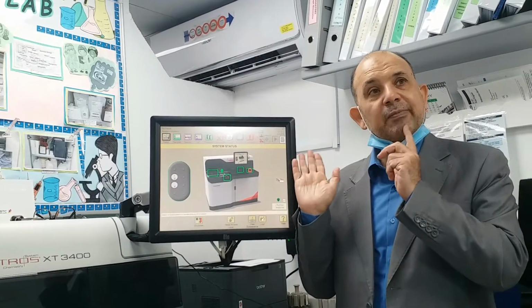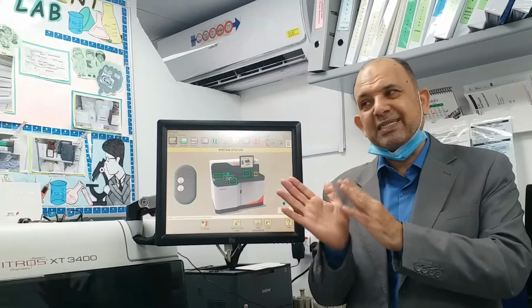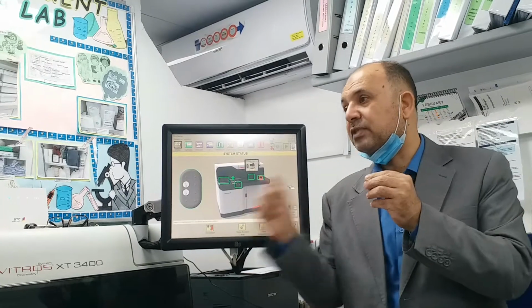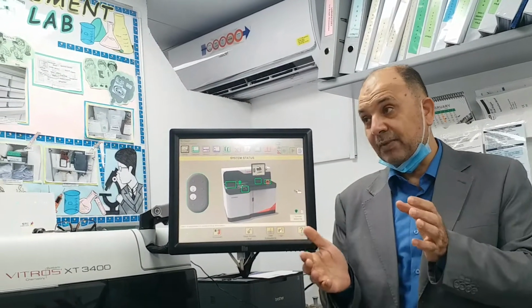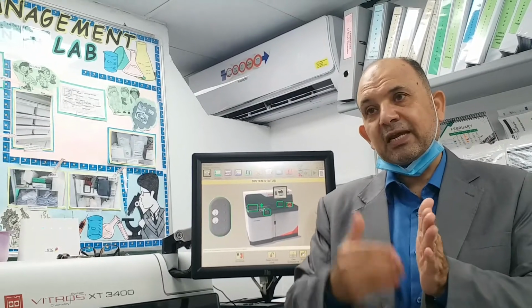Day by day, the analyzer receives data from patients and automatically decides the mean and median for this parameter, storing it over time. Every day you run the same test, it stores it and gets a new mean and median for that analyte.